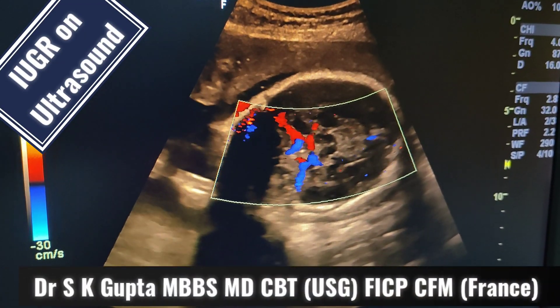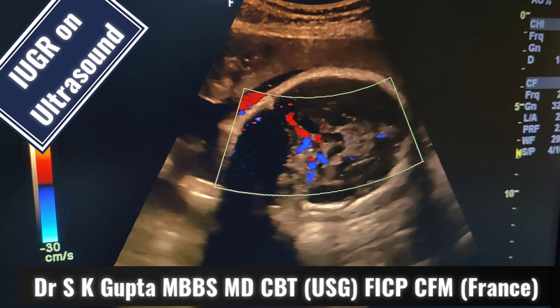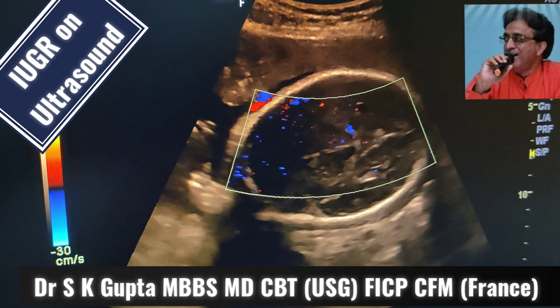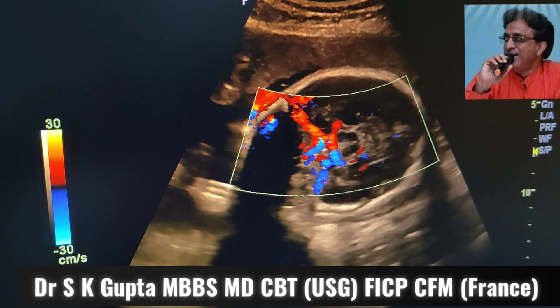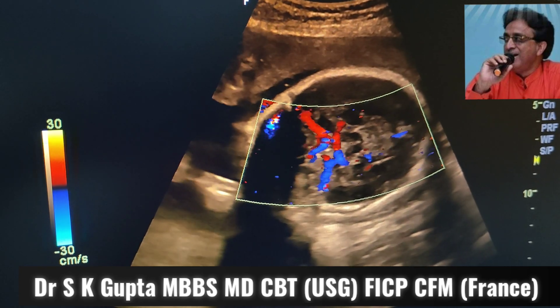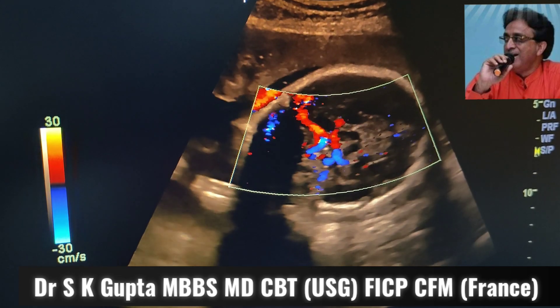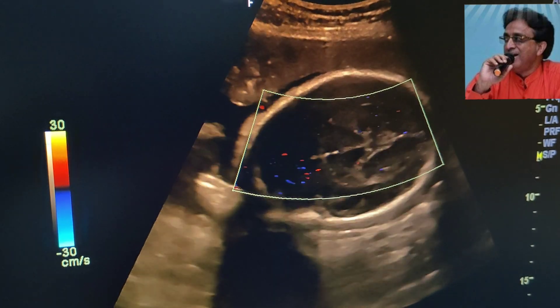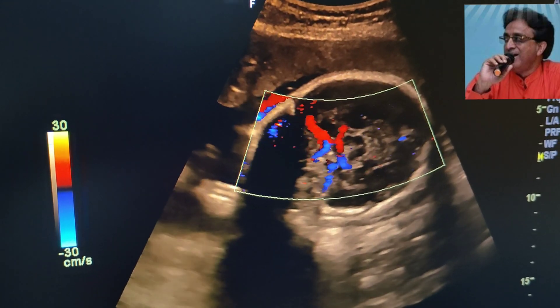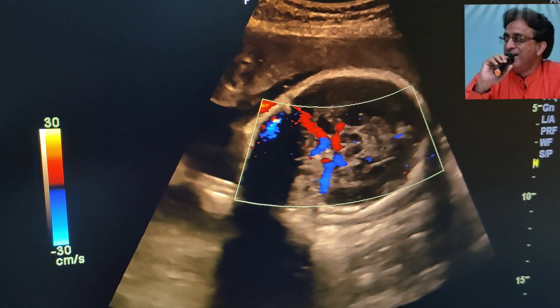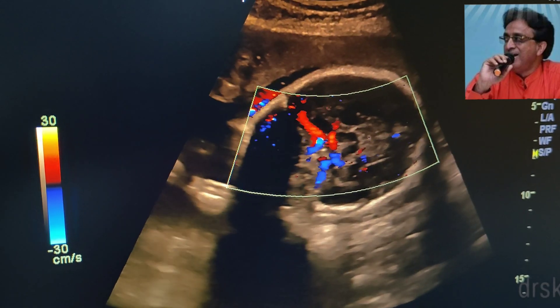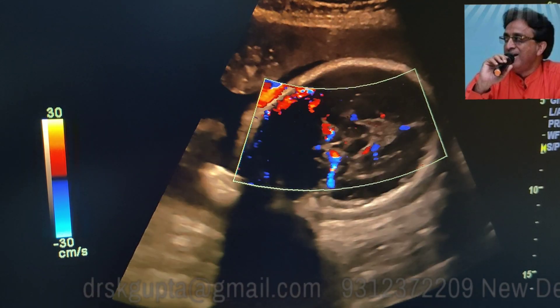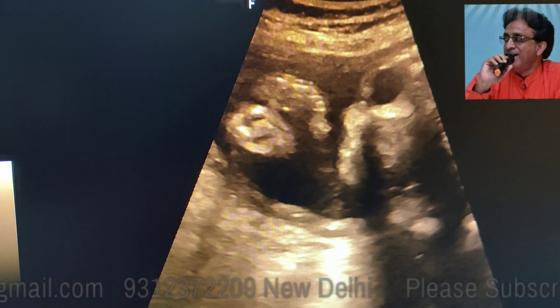Good day friends, I am Dr. Gupta and I am going to demonstrate to you a case of IUGR in a patient who is around 33 weeks of gestation by the last menstrual period. But on actual examination by ultrasound, her gestational age comes to be around 29 weeks 5 days. The obstetrician has considered the possibility of intrauterine growth retardation and this patient has been sent to us for the ultrasound examination.